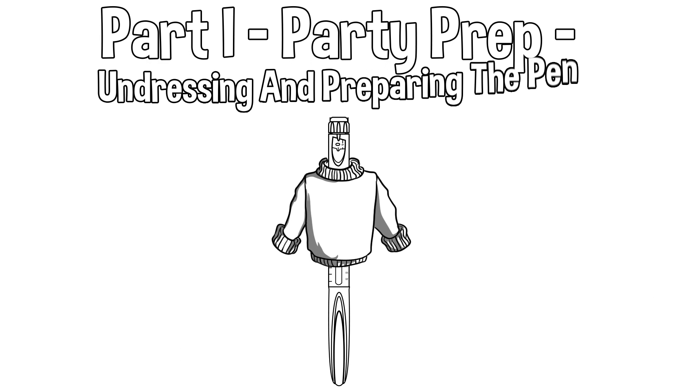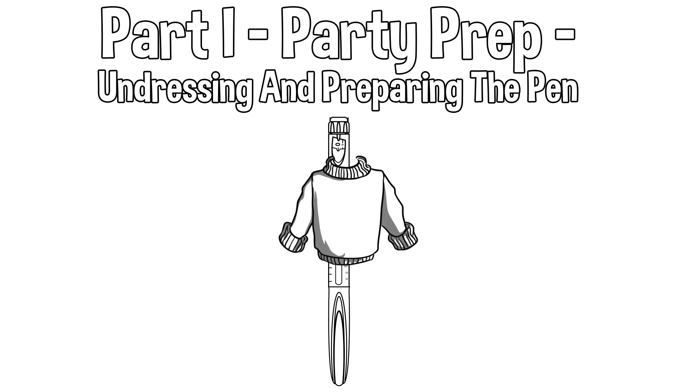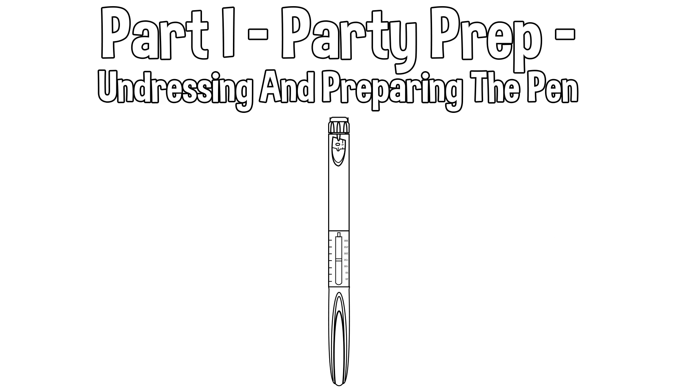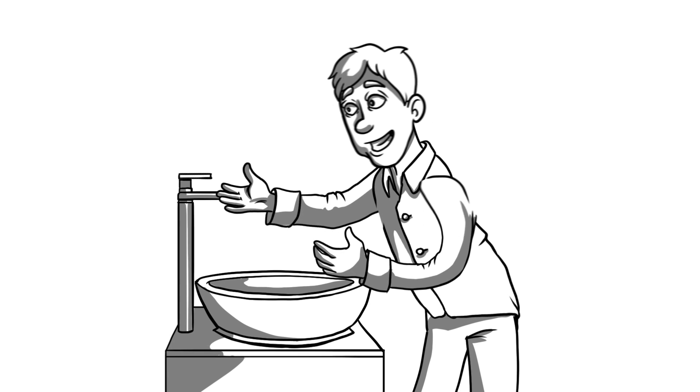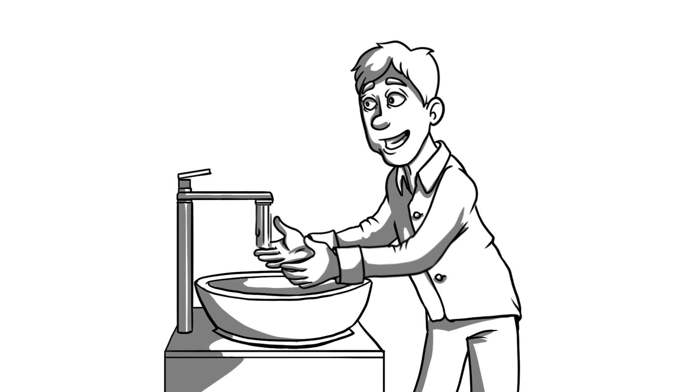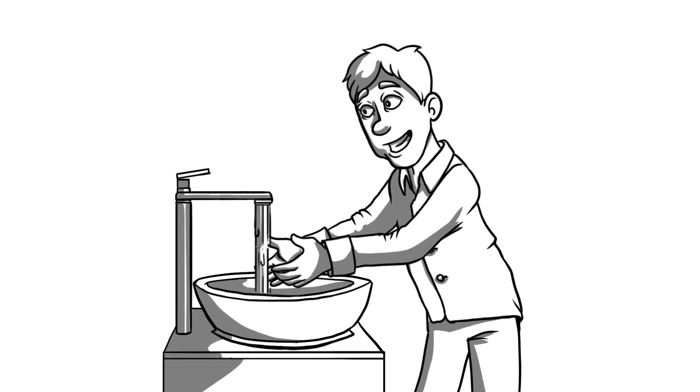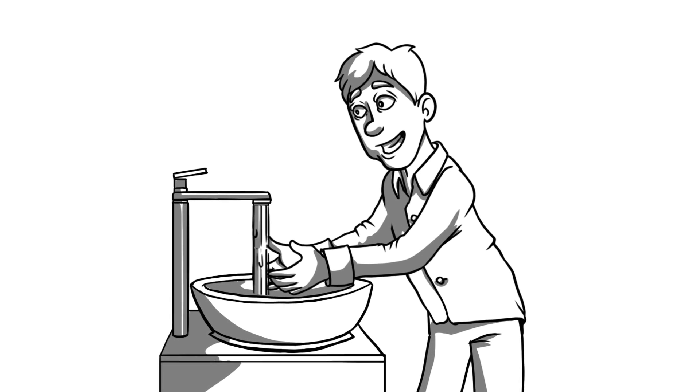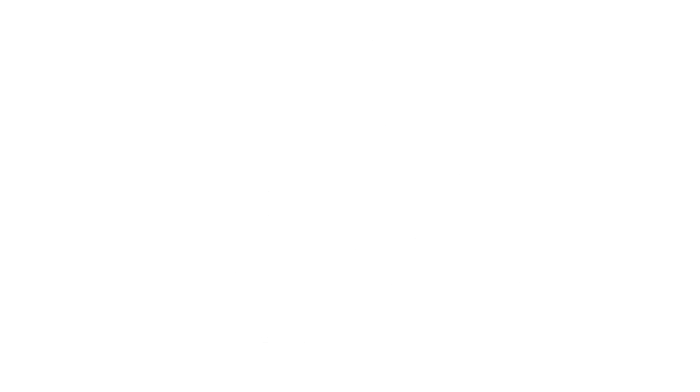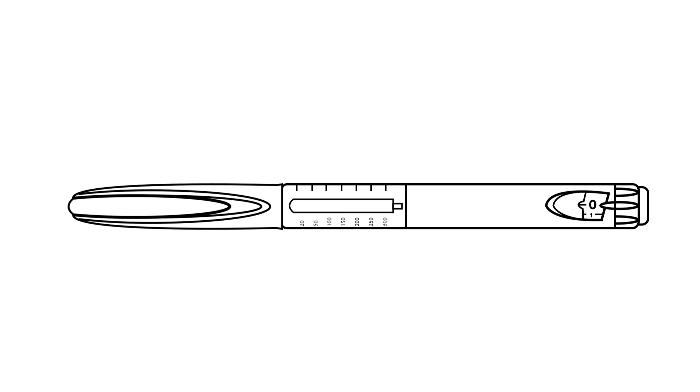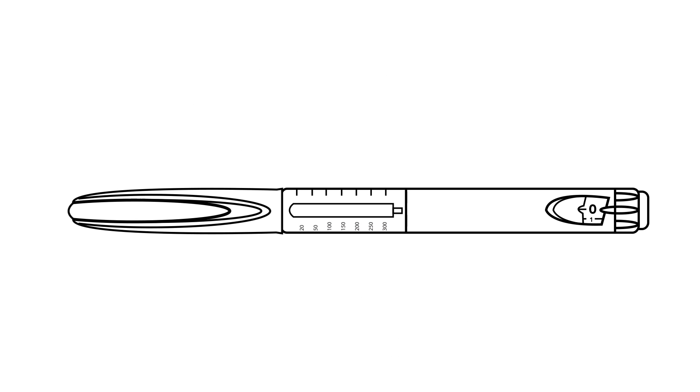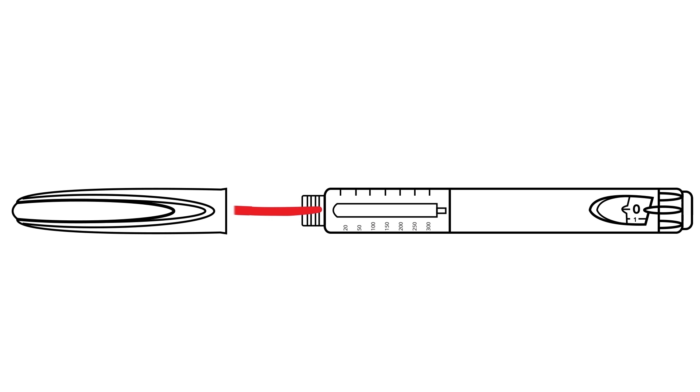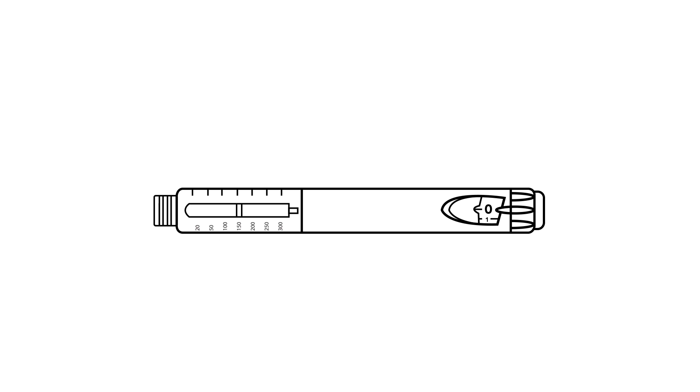Part 1 Party Prep. Undressing and Preparing the Pen. First off, wash your dirty hands. Didn't your mama teach you any manners? Once you are fresh and clean, we will undress the pen by removing the pen cap. The cap should be pulled straight off, no twisting necessary. Now that the insulin pen is naked, check out the goods.